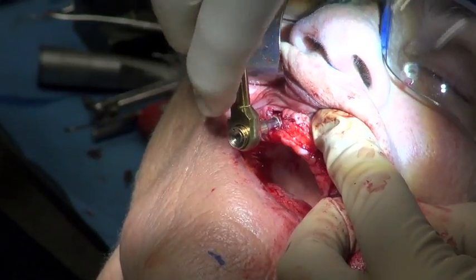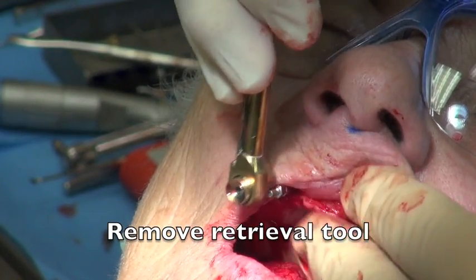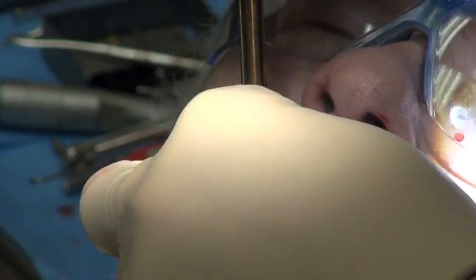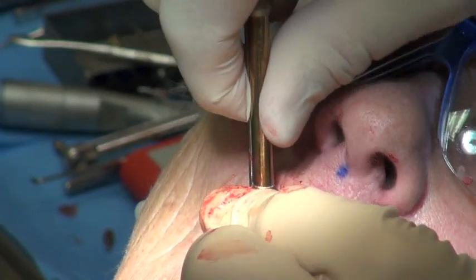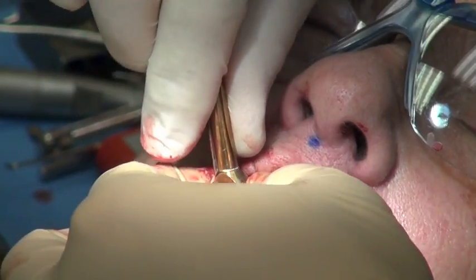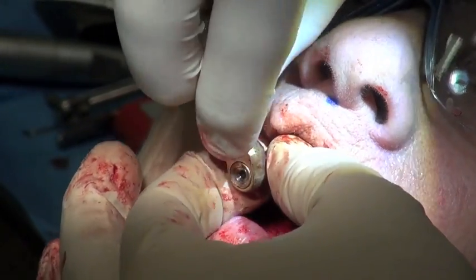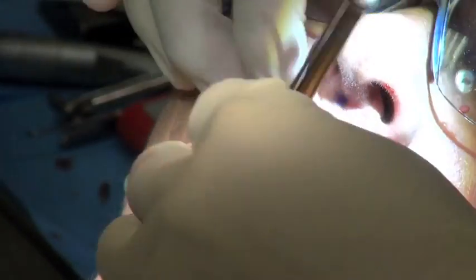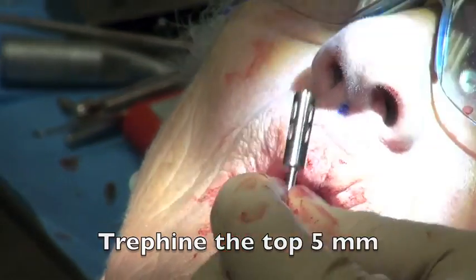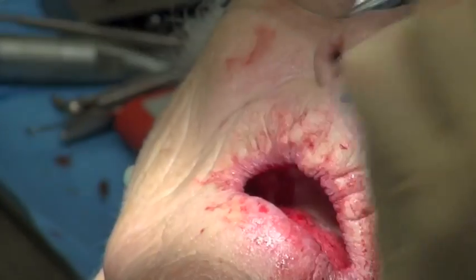Sometimes this retrieval tool needs a little bit of help. We take the retrieval tool out by going clockwise to get it out of the way so we can do more work around the implant without too much damage to the bone. I'll set it aside for a few minutes and come back after we do a little crestal bone work. My goal is to take a trefine and address the top five millimeters of the implant to loosen it up, then go back in and use the retrieval tool.